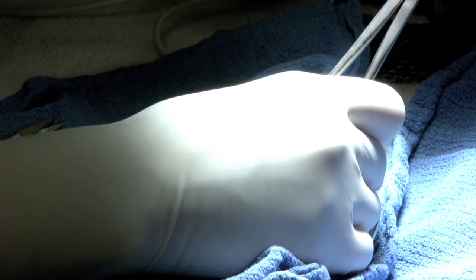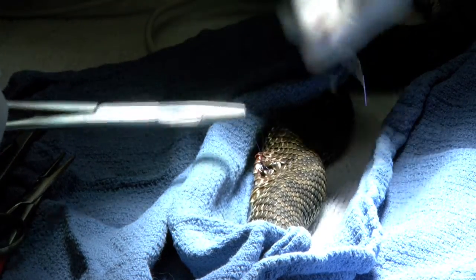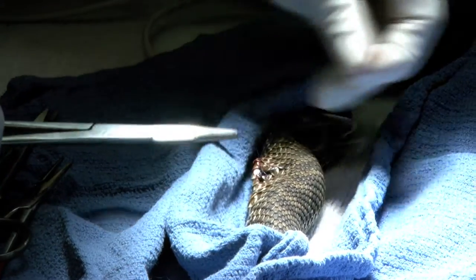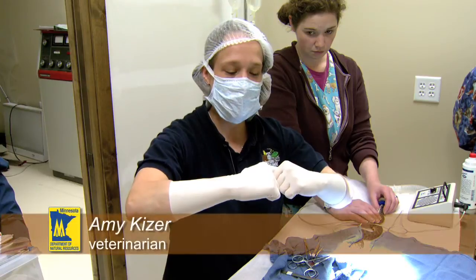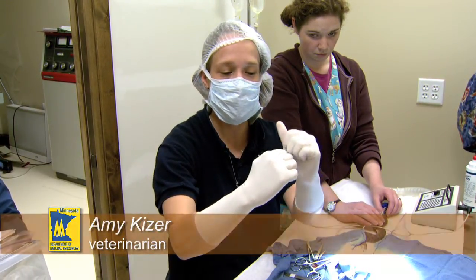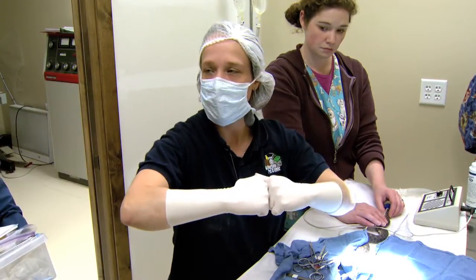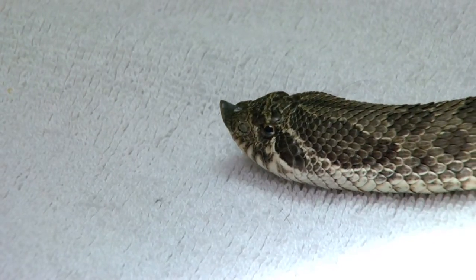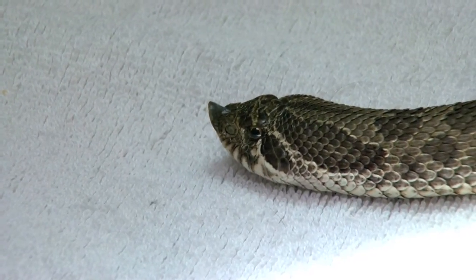We do have to use a certain suture pattern whenever we're suturing scaly skin like this. This is something called an everting pattern. Instead of having the incision healing like this, we actually want it like this because of the scales — we don't want to invert scales, as that's going to affect the healing process. There comes a tongue flicker.